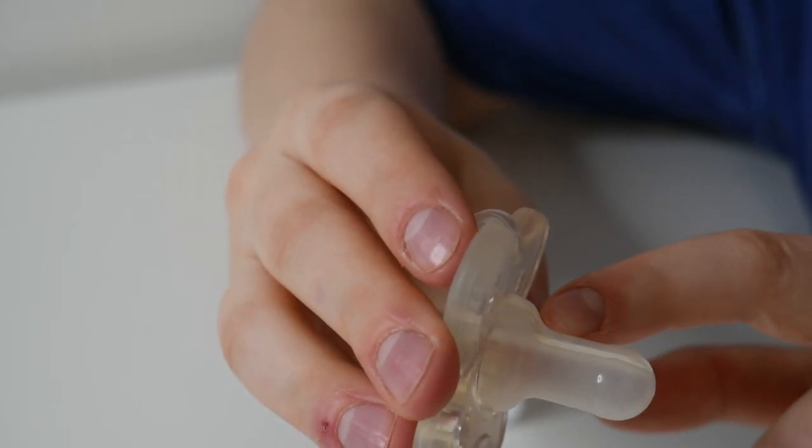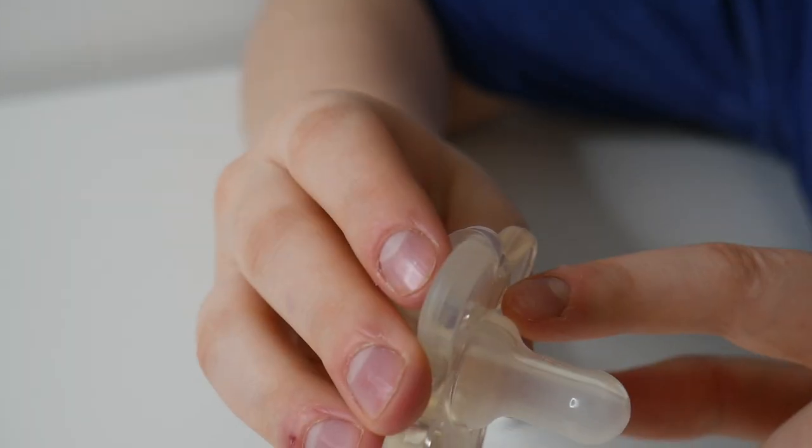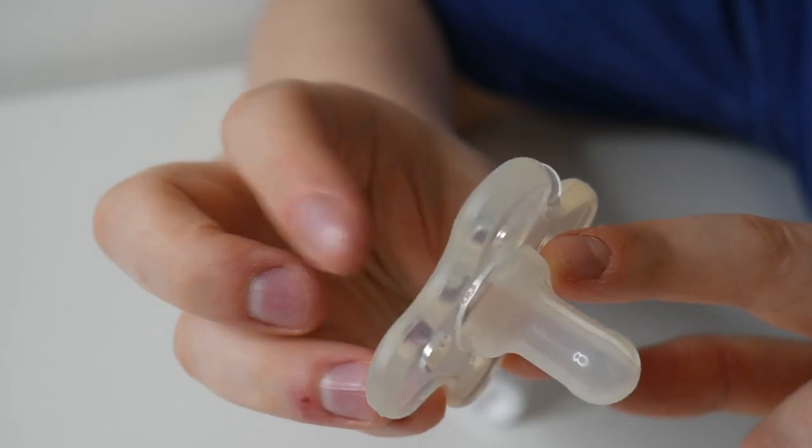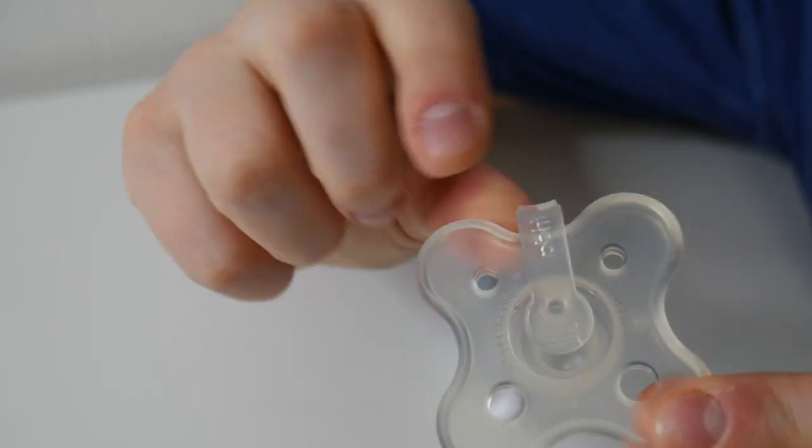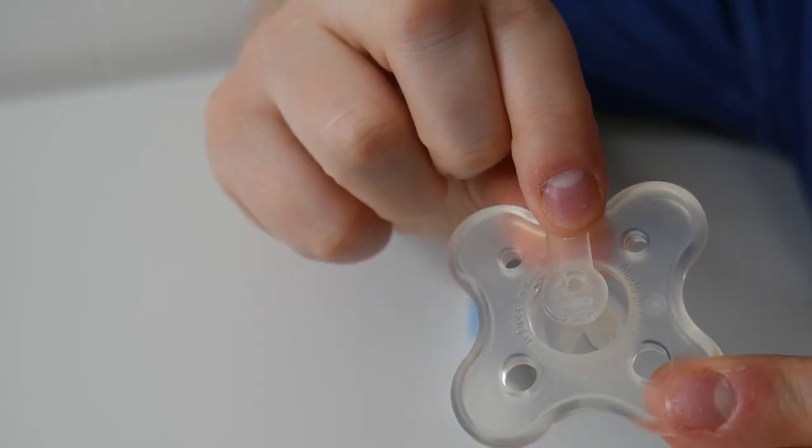And then right here there is the pacifier medicine channel, which is where the medicine will flow from the syringe to your baby's mouth. It also has this little pacifier plug right here, so no medicine spills out.